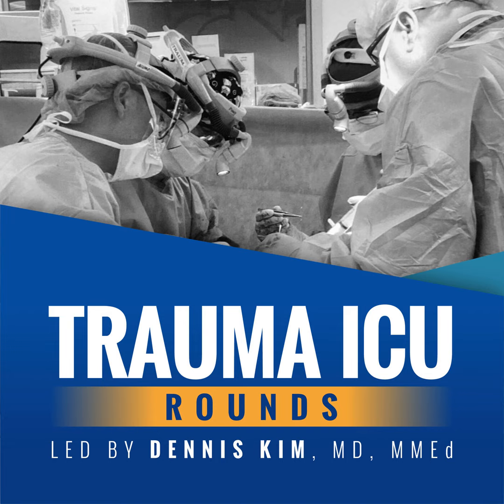But just to give you a heads up, when we think about weaning, let's say using a modality like pressure support ventilation, this would essentially involve placing a patient on pressure support ventilation once we think they're ready for a spontaneous breathing trial, and starting with an arbitrary number like, let's say, 18 centimeters of water, and maybe every 12 hours or twice a day reassessing the patient for the potential of decreasing that pressure support by 2 to 4 centimeters of water to the point where the patient is on minimal vent settings, at which point we would consider extubating the patient.